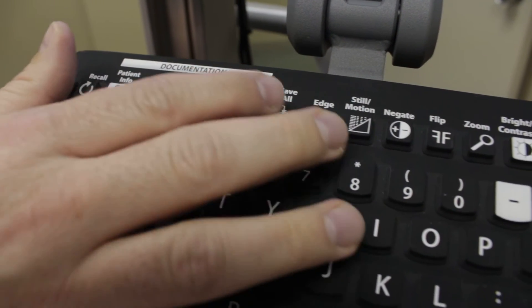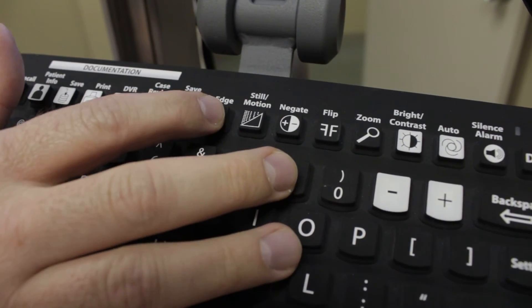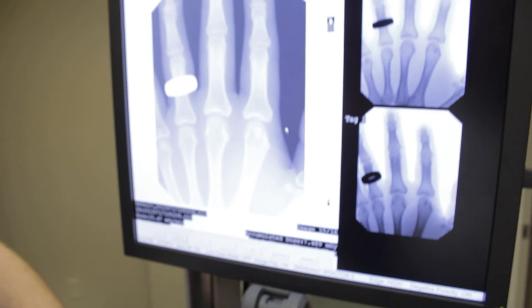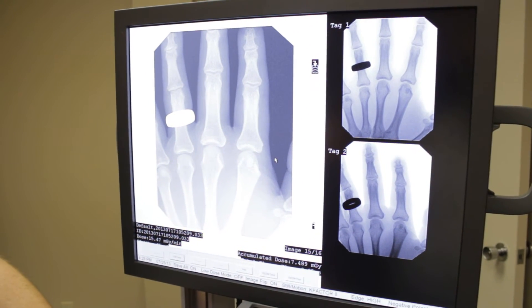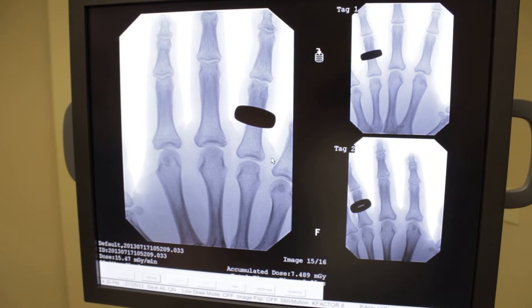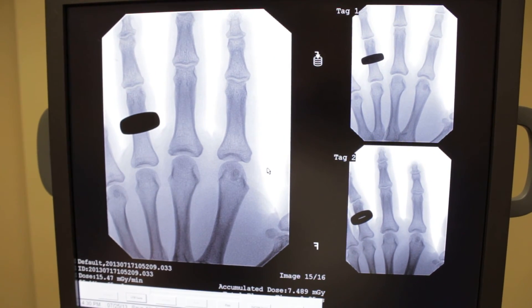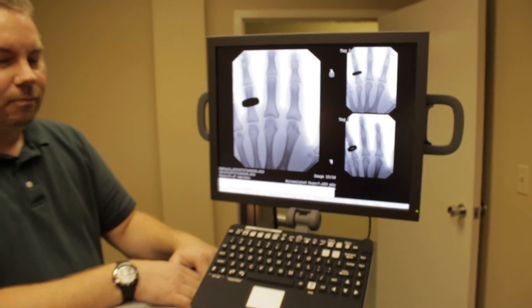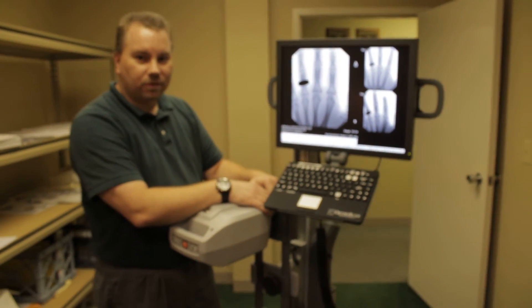We also have the ability to sharpen the image and add negative effects, so you can look for debris like soft tissue, flip the image, and all kinds of other wonderful features for this highly mobile, highly portable Mobile DI from OrthoScan.